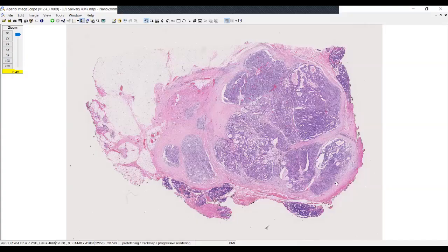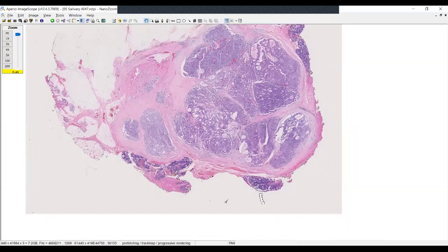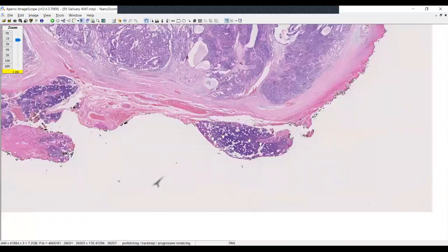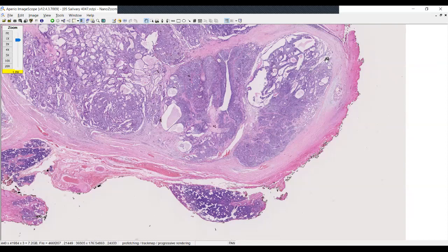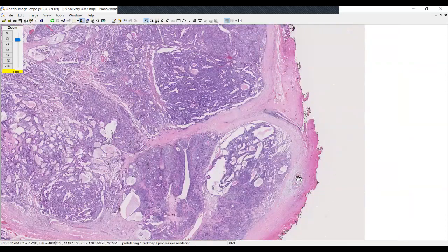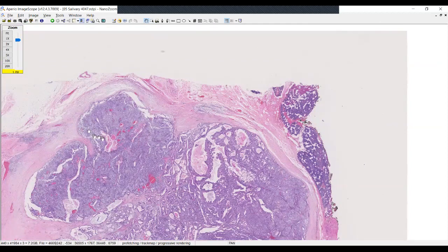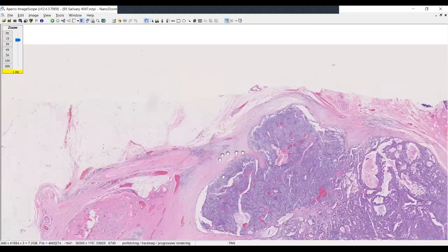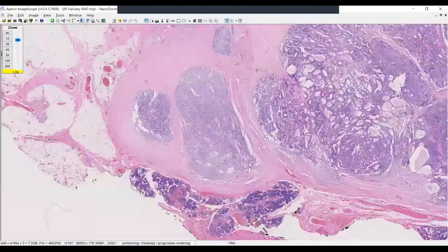Here you can see a salivary gland lesion. So a little bit different in this case. Whenever I approach a salivary gland, I also like to look first at the periphery to get a feel for what it is that I am reviewing. And I think you will notice in this example, the salivary gland tissue is really very meager at the periphery. While you have a lobulated mass, there is an area of extension of the tumor out over here, and multiple nodules appearing to be destructively invasive out into the surrounding parenchyma.